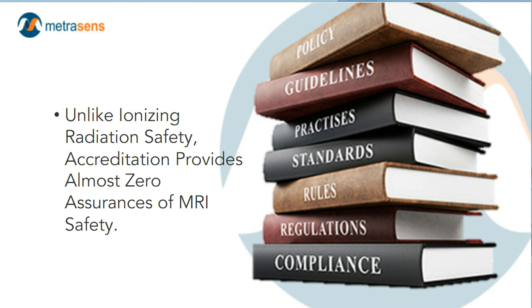Well, here's the thing. Almost all of those regulations on safety in radiology pertain to ionizing radiation exposure, the radiation that makes you glow in the dark. Okay, it doesn't really make you glow in the dark, but you get the idea. The chromosomal damage type of radiation, of which MRI is outside.